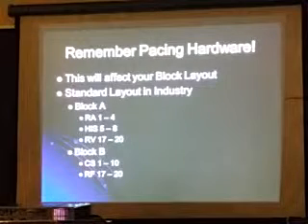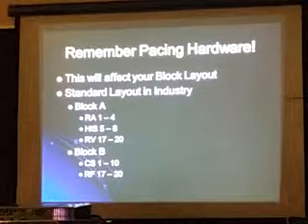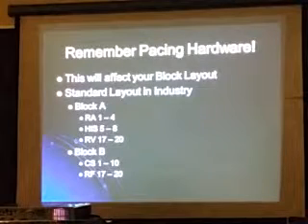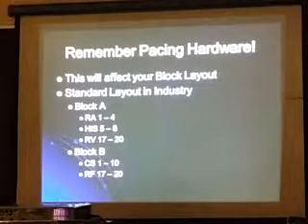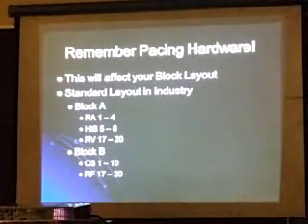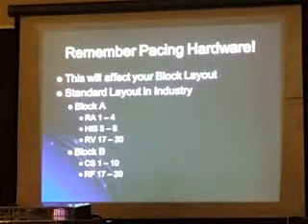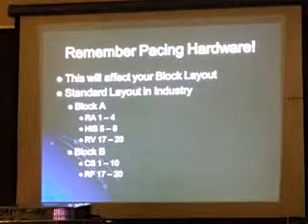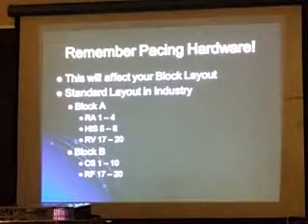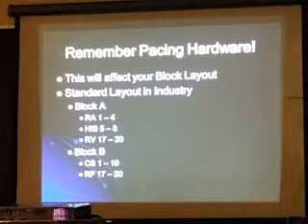I've seen noise on your HIS, and by turning off that 2-3 connection, it goes away. Why? I'm electrically connecting all 4 electrodes together and creating an antenna that's this big instead of one that's this big. I've seen that happen with the lasso catheters as well, because we're connecting like 10 electrodes in a circle all together, and once we took those little interconnections out, so each was its own separate electrode pair, the noise went away. Lots of noise. It makes it nice and convenient, but that goes back to poor catheter position, laziness.